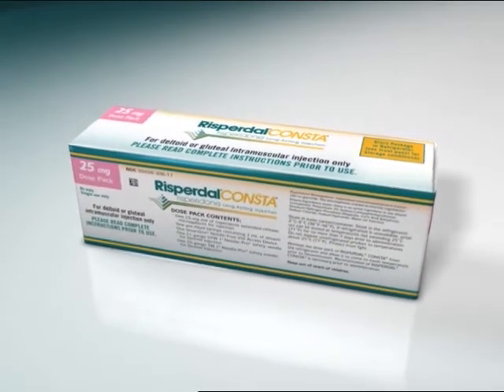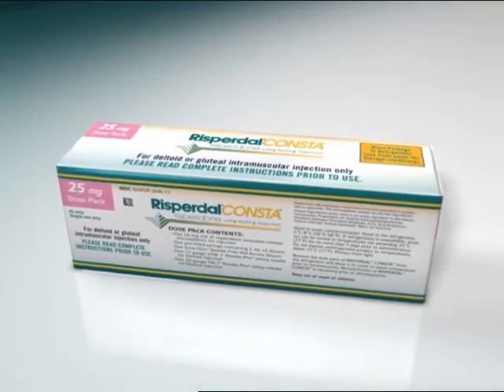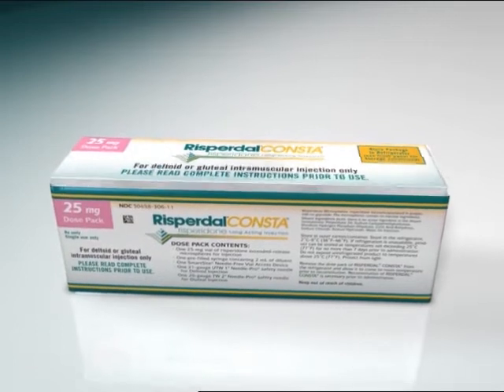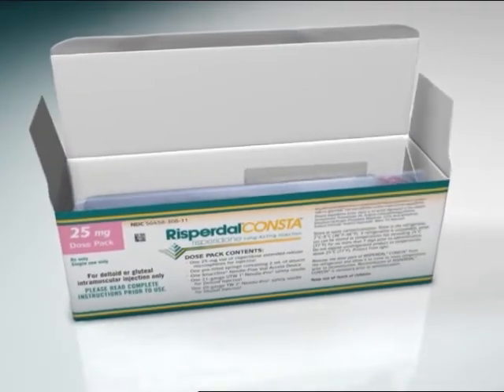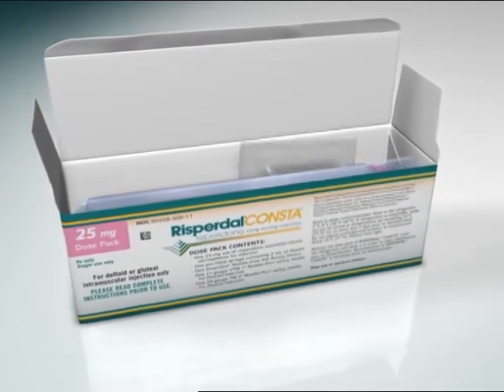An innovative delivery system has been designed to accommodate the Risperdal Consta microspheres. The dose pack contains all of the components needed to provide Risperdal Consta and is easy to assemble and administer.